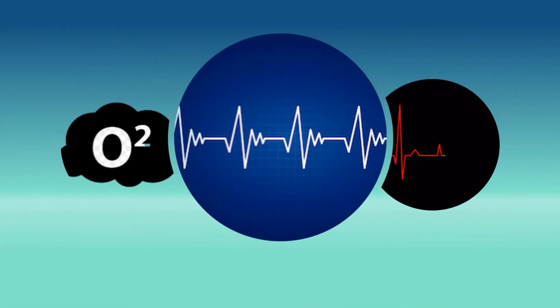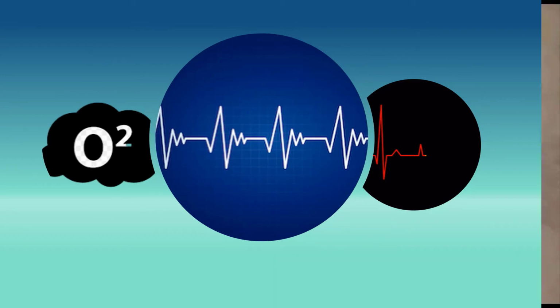The first case is the increase in heart rate. The second case is a decrease in heart rate. And the last case is a drop in oxygen saturation.